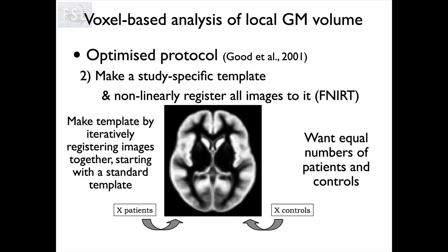We can actually analyze everything later on, and it can be in unequal groups for the later analysis. But specifically for building the template, we have to have a balanced subset from, in this case, the 2 groups, but if we had more groups, we would have a balanced number from each of the groups which constituted our data set.